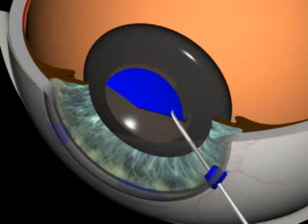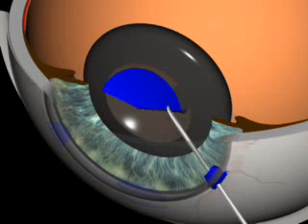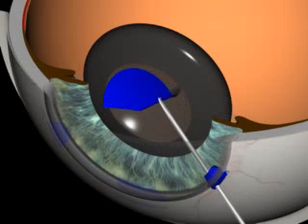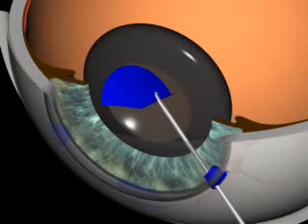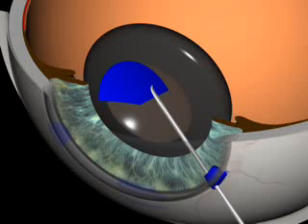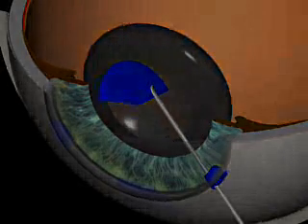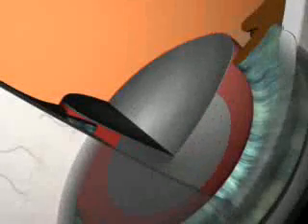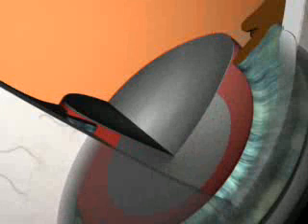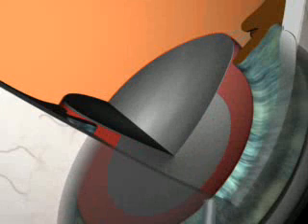Hydrodissection. Fluid is injected into the cortical layer of the lens under the lens capsule.